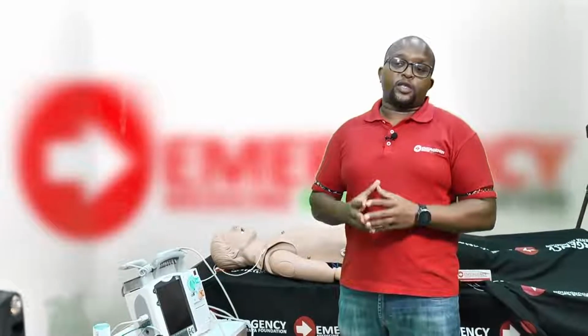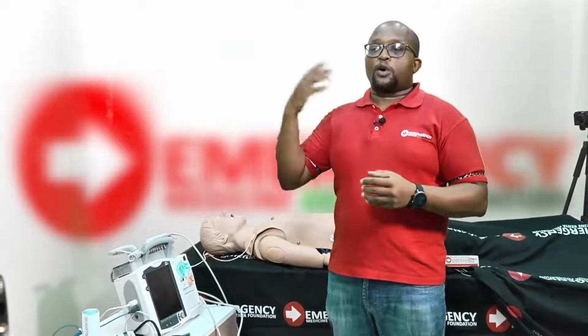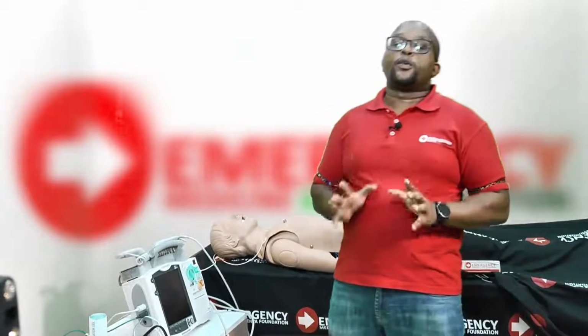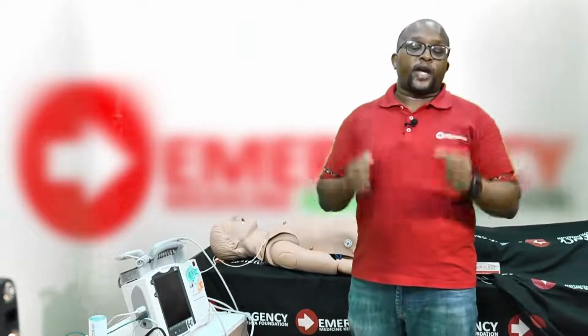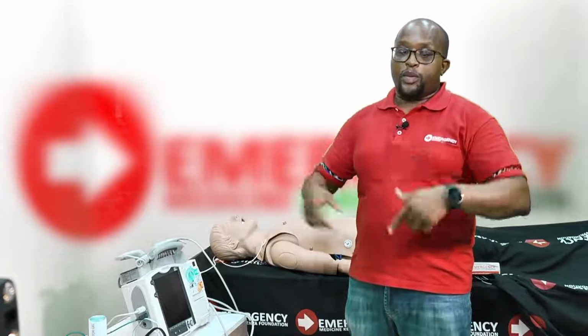That's one important thing. These two rhythms are uncoordinated rhythms, or coordinated rhythms without a pulse, for example, pulseless ventricular tachycardia, that you need to be able to identify on a monitor and provide an immediate shock to the patient to allow the rhythm to pick up.